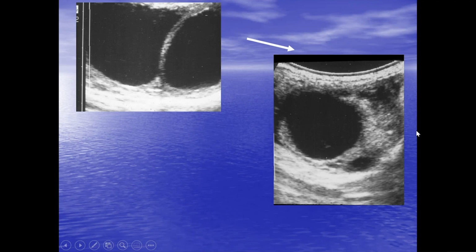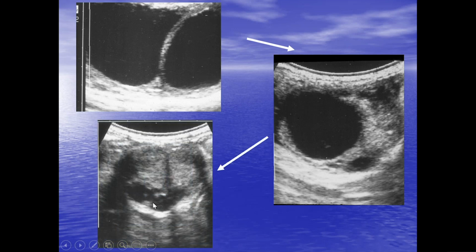It can be difficult to detect the very fresh ovulation. Hasn't really had time to organize, form an obvious corpus luteum. But there you can see it, but an indistinct structure. And then if we went back the following day to this mare, a bit more obvious. We can see there we've got the 2 corpora lutea.